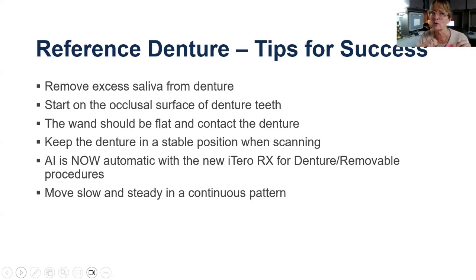So keeping it stable. Some people will ask me, well, what about putting it on a tabletop, on the counter at your office? And I have not had success with that. And I've tried to put sticky tack and things to keep the denture from moving, but it still wants to slide away from me. So I haven't had great success with that. But keep it dry and free of any kind of tartar, glue, reline material, things like that. You want to make sure that it's clean of that.